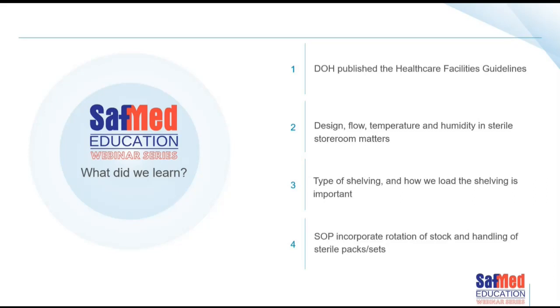The design, flow, temperature, and humidity in the sterile storeroom matters. The type of shelving we use and how we load that shelving is important. We should have very clear standard operating procedures that incorporate aspects like stock rotation and handling of our sterile packs and sets to make sure that we can maintain the sterility of our packs until such time as they are used.